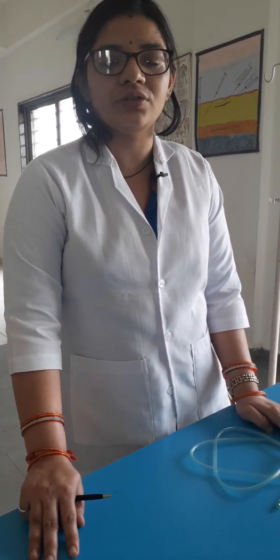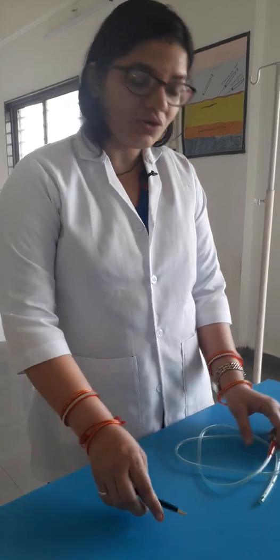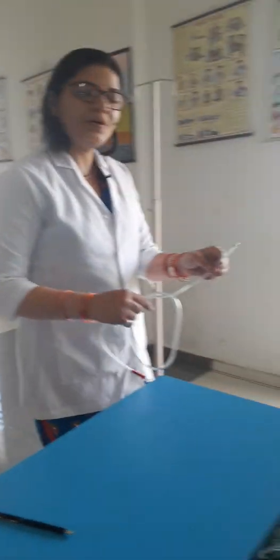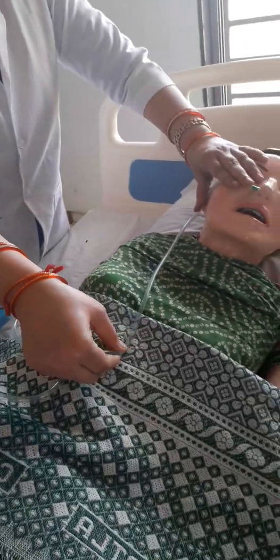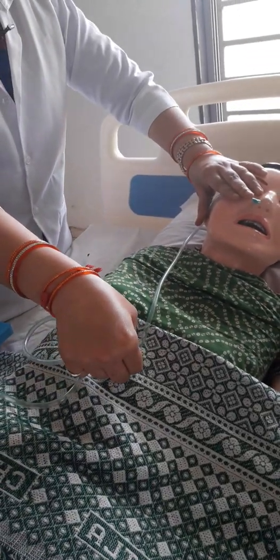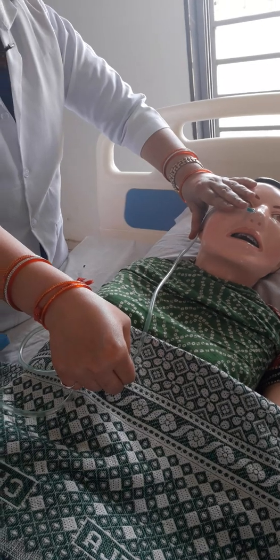Whenever you insert the NG tube, it is very important to know how to measure it. Always remember: from the nose tip to the earlobe, and then from there to 5 centimeters less than the xiphoid process. That is how you check the length of the Riles tube to be inserted.